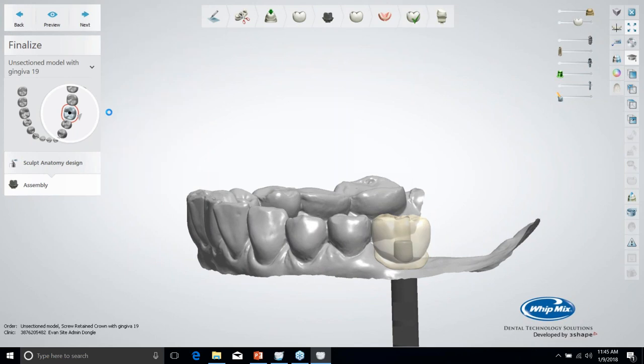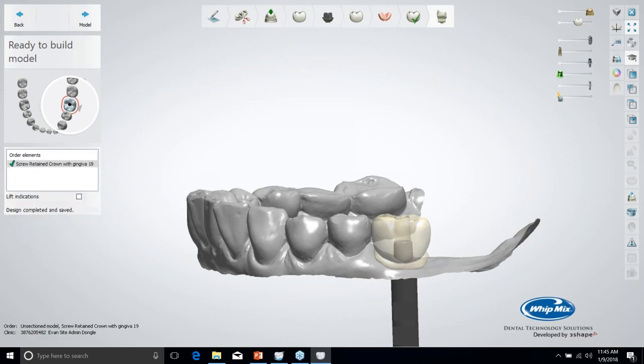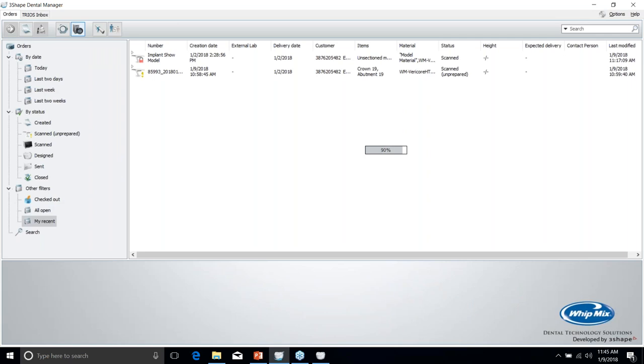So then we can just go next. It's going to finalize the design. And as long as you get your green check here, that means that it's saved the design. So real quick, I did have this set up to do a digital model.